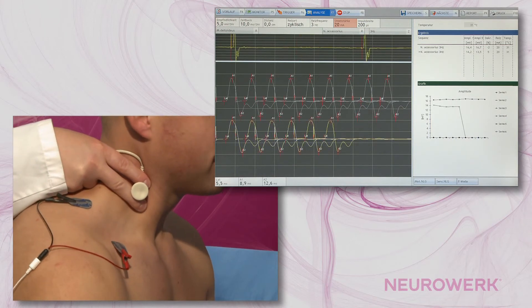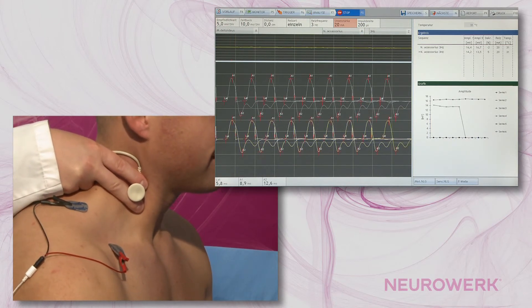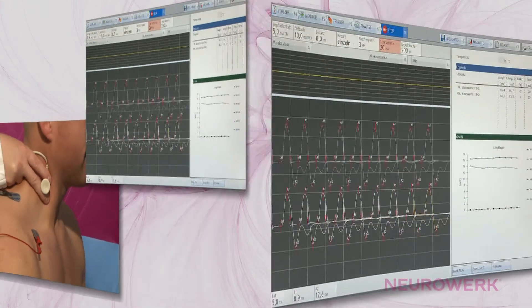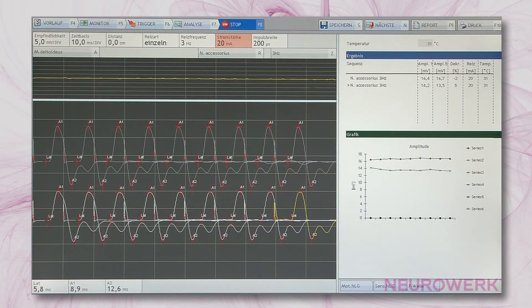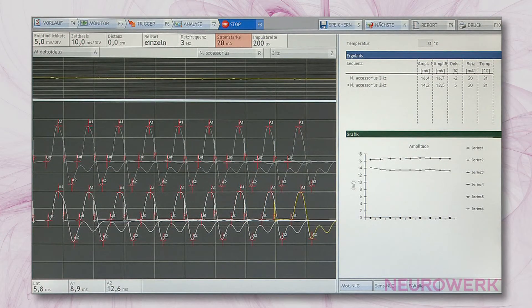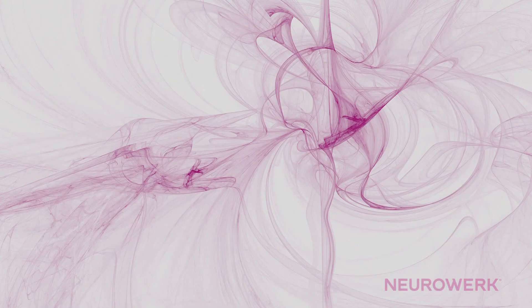Subsequently, the measurement is repeated with the same stimulus intensity as was used at the first stage. Displayed in the results table are the amplitude values of the individual measurements and the decrement, that is, the amplitude reduction in percentage form. The amplitude decrease is also shown in a descriptive manner in the graph.